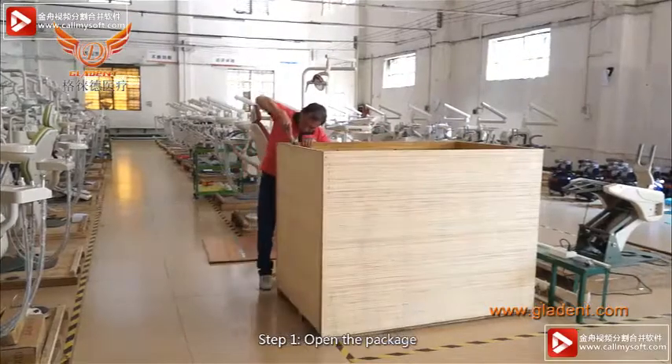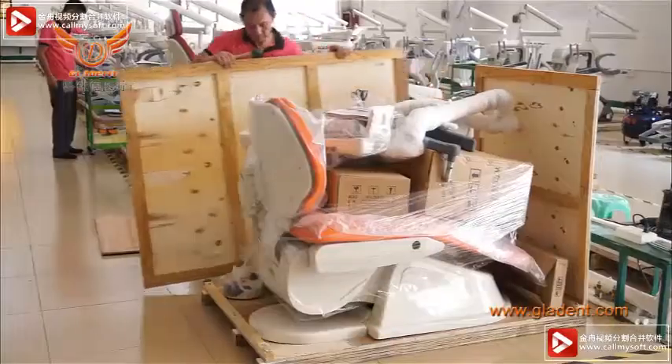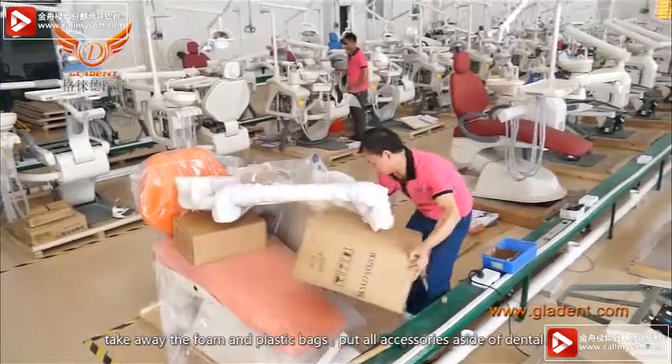Step 1. Open the package. Take away the foam and plastic bags.